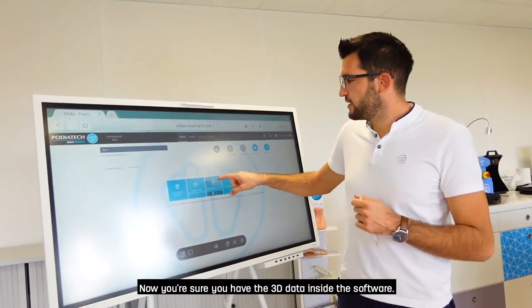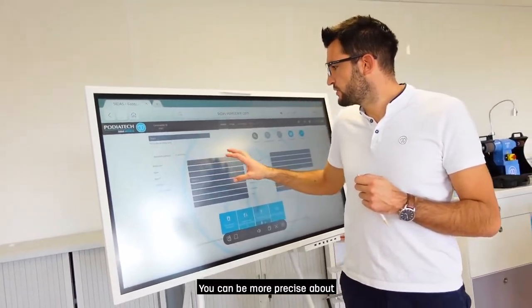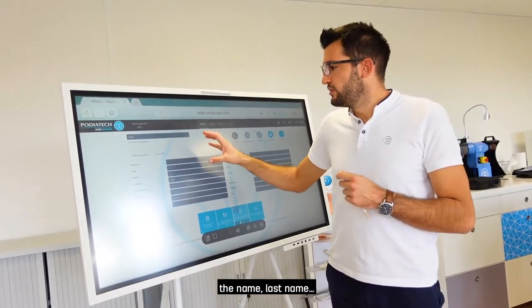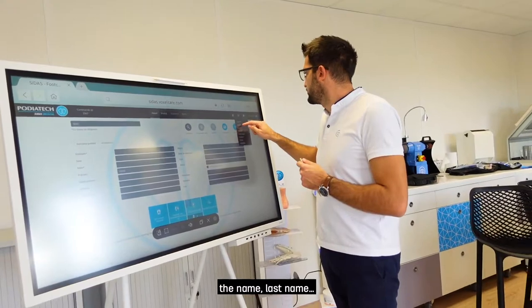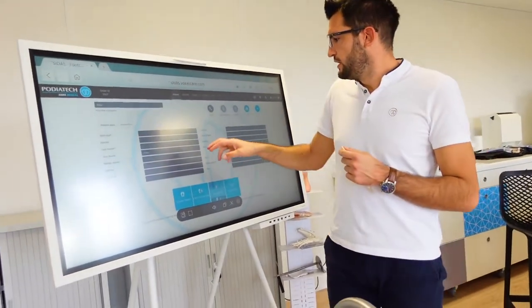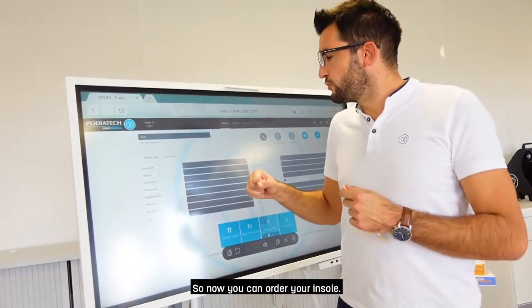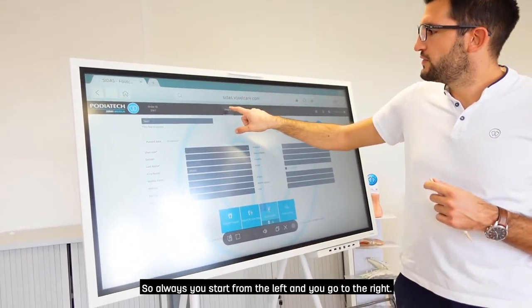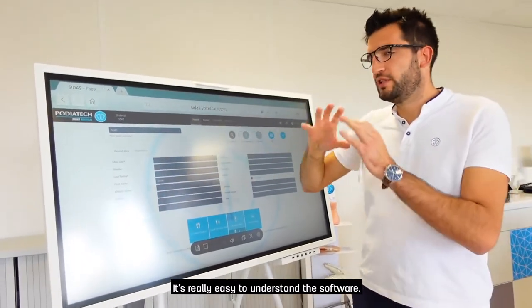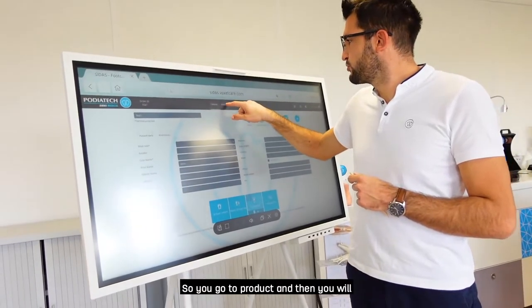Now you're sure you have the 3D data inside the software. You can also be more precise about the name, last name, and so on. You can now order your insoles — always start from the left and go to the right. The software is easy to understand. Go to Product and you will have three ways to personalize your insoles.